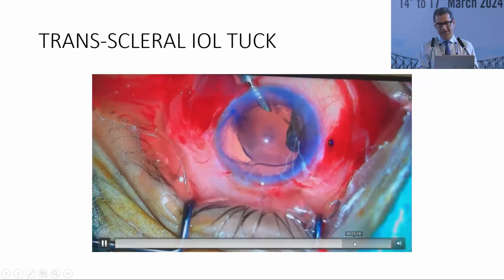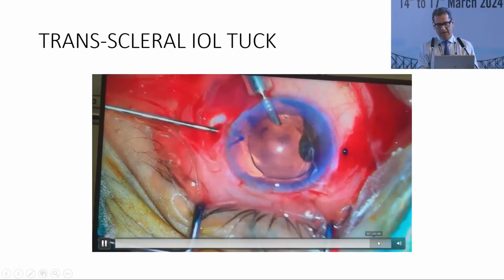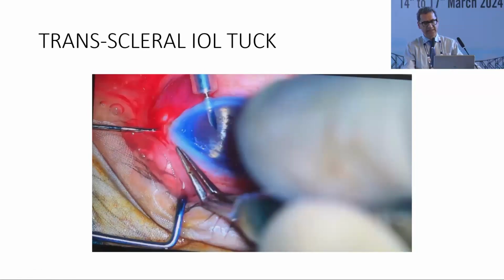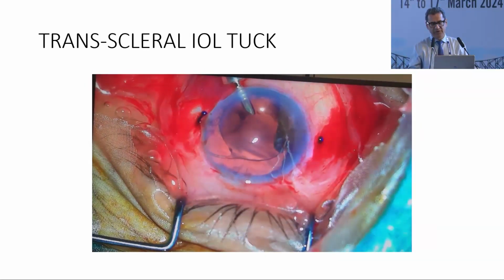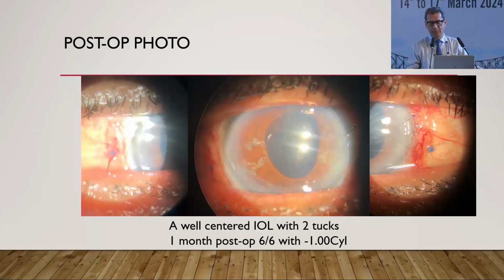This is the unedited version I'm showing you, so just bear with me. And now I think I've managed to get it out. So just feed it out and then it comes out. And then you shove it into the groove which I said, which you create after further dumbbellizing it, and then you're done with the surgery. And the centration is beautiful. I had a lens tilt in a few of these patients of mine, I won't deny that. But then it's not a very visually significant problem. So this is how the post-op looks.